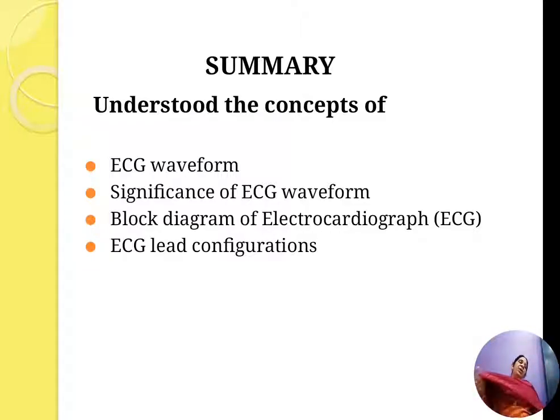So ECG deals with the study of electrical activity of the heart muscles. The potentials originated in the individual fibers of the heart muscles are added to produce the ECG waveform.